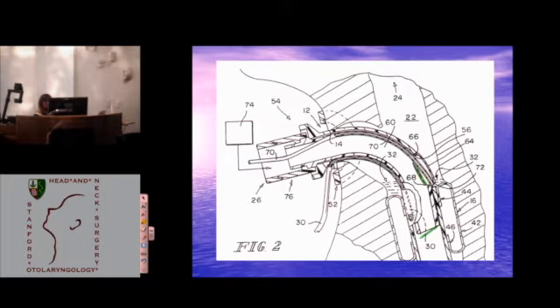So we've got a standard tracheostomy tube now, except right above the cuff, 1 millimeter above the cuff. In fact, the band that glues the cuff on is turned inside the cuff so we can put a fenestration right above the cuff. Number one, because most surgeons and physicians will say, oh, sorry, don't want to hear any more about that. We don't use fenestrated tubes because fenestrated tubes cause granulation tissue. Well, do a real exhaustive search in the literature, you're going to find that that's not well documented. But nonetheless, the fenestration, which is about this large, is right above the cuff. You have a cuff that's propping the fenestration off the wall, even if it were to come in contact.